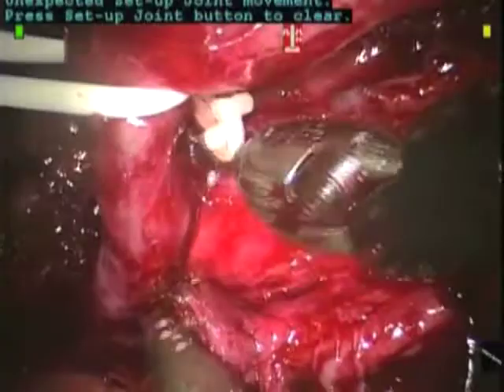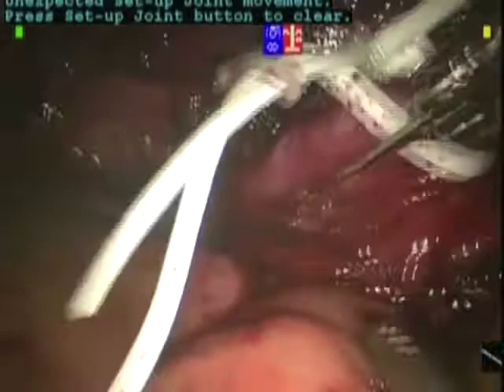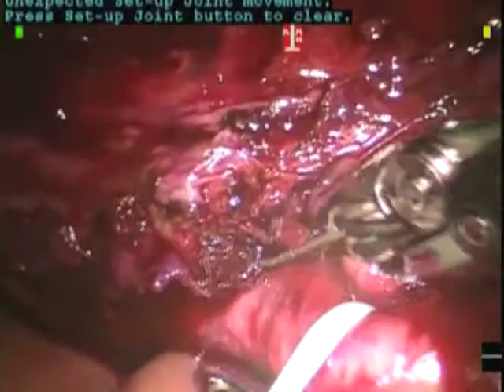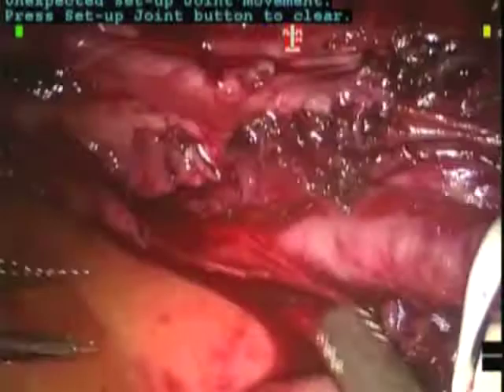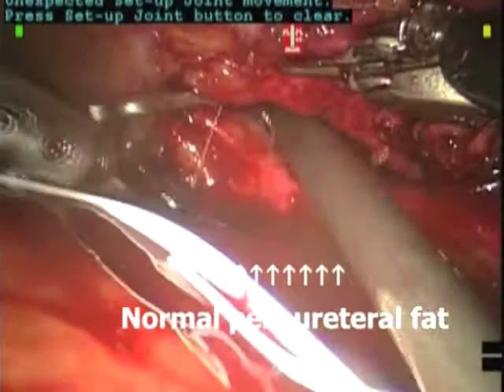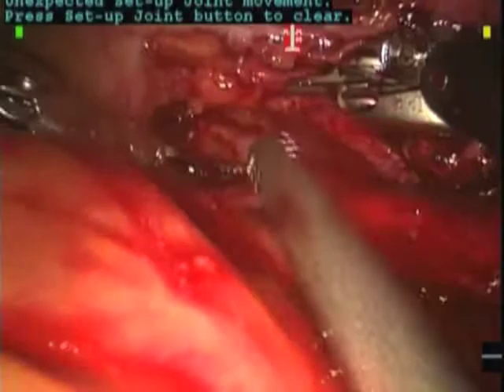Again, you can see the vessel loop being used as traction to pull the ureter away from the iliac artery and out of the rind. This stepwise dissection releasing the ureter out of the fibrotic mass is performed sequentially from known to unknown all the way toward the bladder. Here you see normal fat surrounding the ureter, which is a sign that we have now released the ureter completely outside of the fibrotic mass.